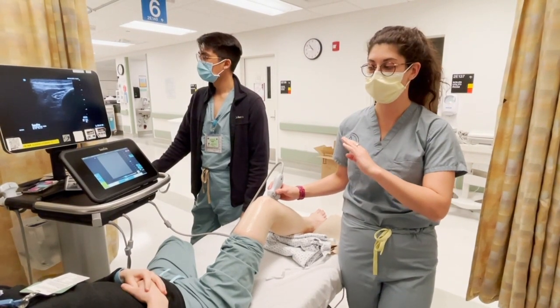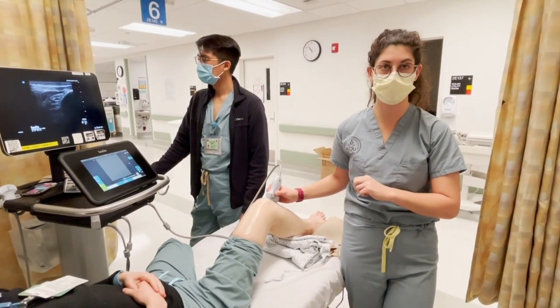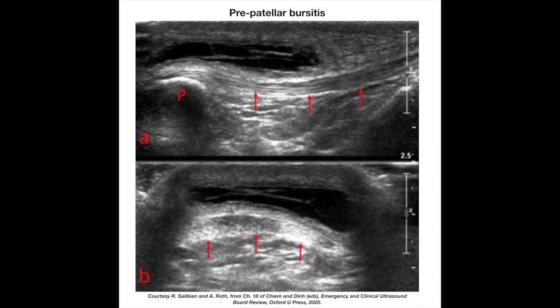These are long and short axis images of a pre-patellar bursitis. On physical exam you'll feel some bogginess over the patella or the patellar ligament. On ultrasound you'll identify the patellar ligament — seen as those red arrows — and note that the fluid collection is just above the ligament itself.